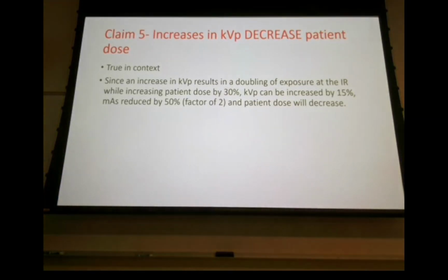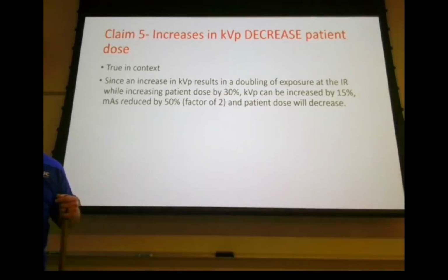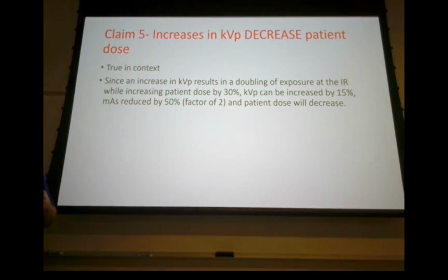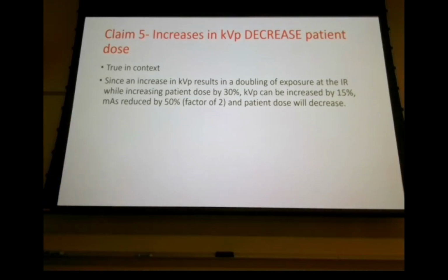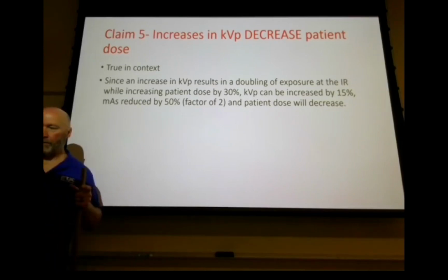What are your options for shortening exposure time? You can increase mA and decrease time, and we call that the law of reciprocity, right? Give and take. Or you can increase your kVp, and that's gonna enable you to use a reduction in time to reduce overall mAs. If you're phototiming, you increase your kVp, and your mAs is naturally gonna go down. It's gonna work your 15% rule for you. So you're gonna look for things on your test question.